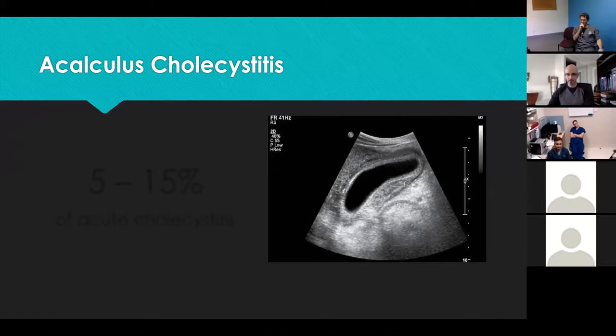Also, Payam, is there any criteria for drainage of the gallbladder? Because often the concern in ICU is, say, this patient has deranged LFTs. We do an ultrasound, we see a distended gallbladder. We're not sure whether it's cholecystitis because we can't confirm with two criteria, and we have to kind of source control and drain, or put a drain in the gallbladder. Is there any kind of guidance around it?